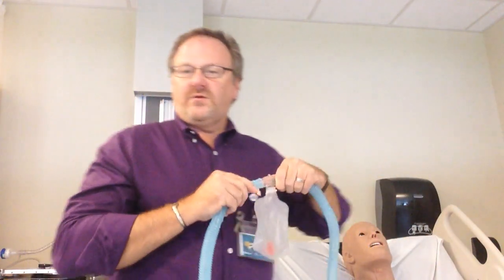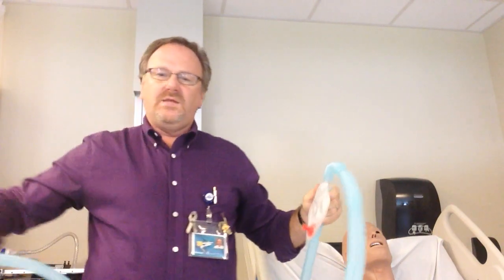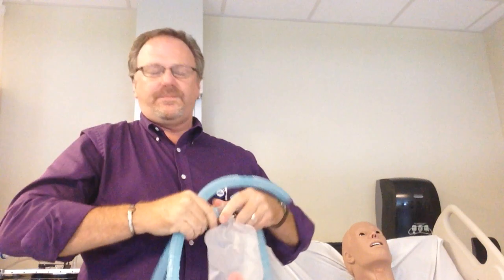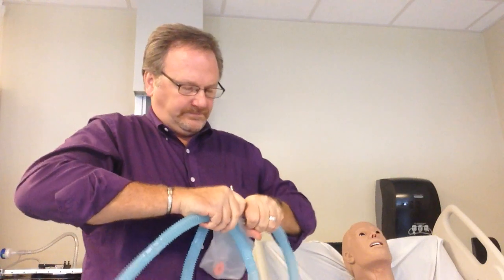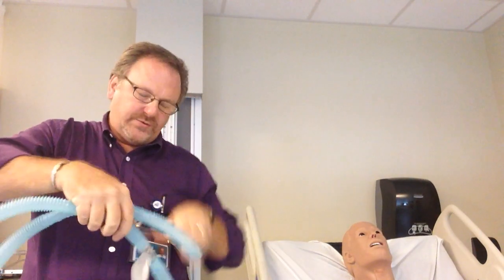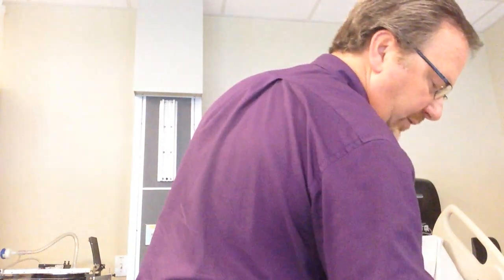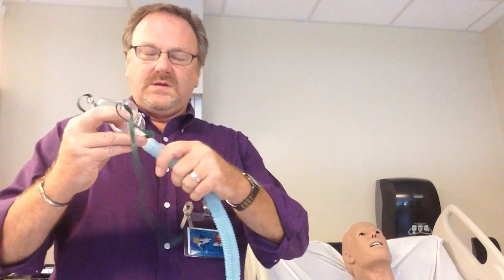Then you take your second section of corrugated tubing. If at any time any of this hits the floor in the hospital, you will have to replace it. For lab competency, if it hits the floor, you will have to verbalize that it hit the floor and that you will replace it. I did let this hit the floor, but that is fine because it is a closed piece and bacteria cannot get on the inside. Then connect whatever device you want — face tent, trach collar, or aerosol face mask. Let's go with trach collar.